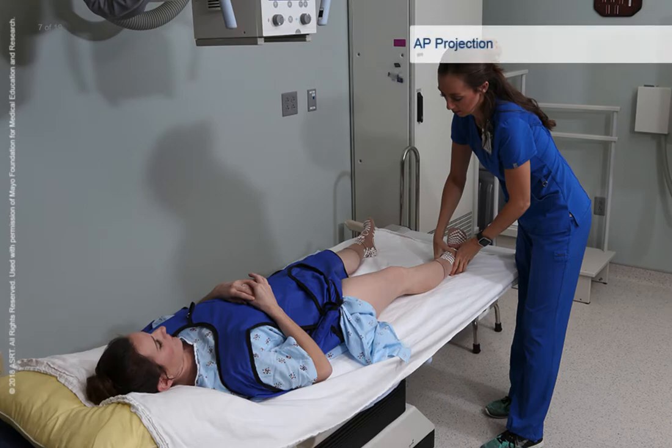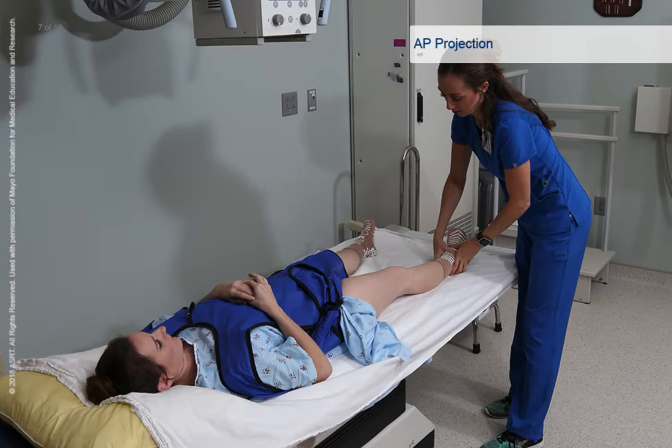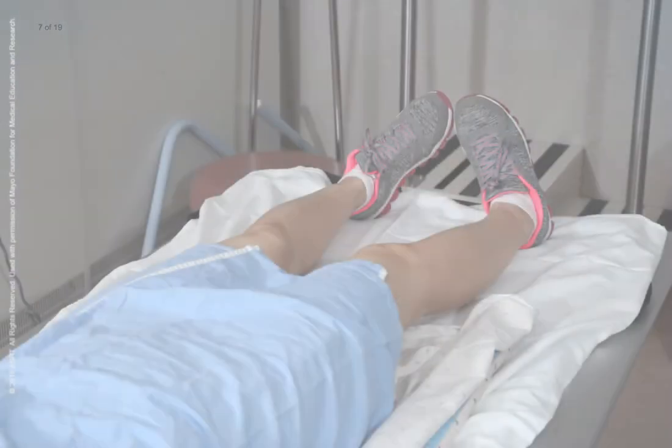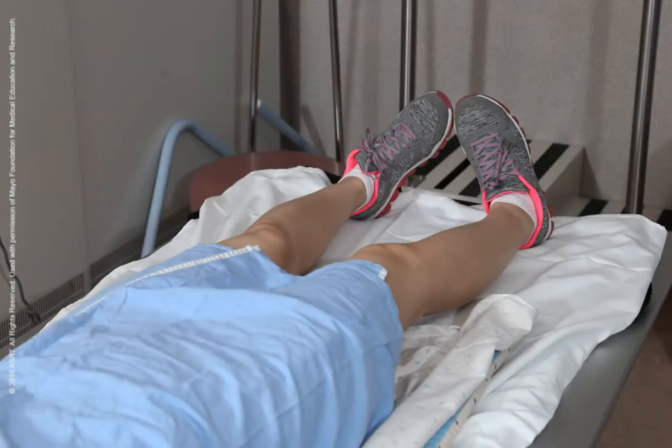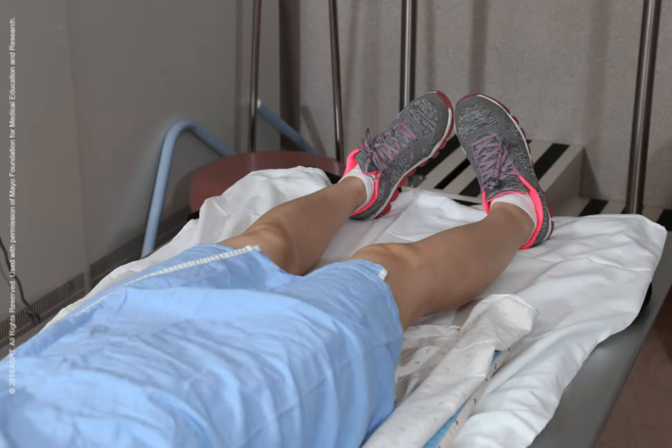The AP projection of the femur is performed with the patient positioned supine on the radiographic table and the leg extended. Make sure the patient's pelvis is not rotated. The affected femur is centered to the midline of the image receptor. A projection of the proximal femur includes the hip joint. For the proximal projection, the patient's leg is internally rotated 10 to 15 degrees from anatomical position in order to visualize the femoral neck in profile.